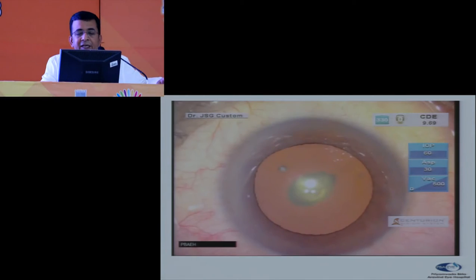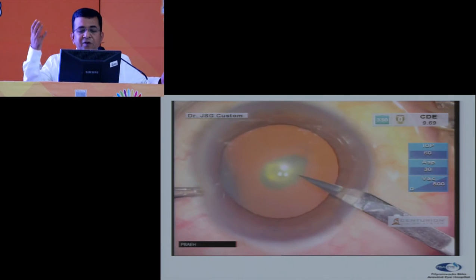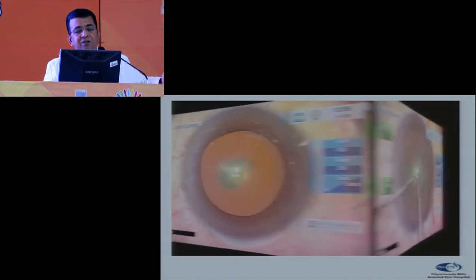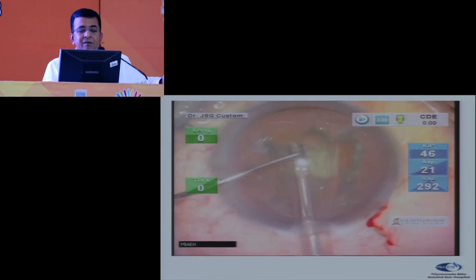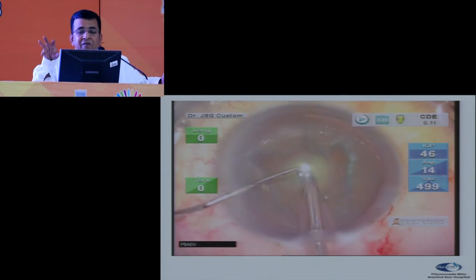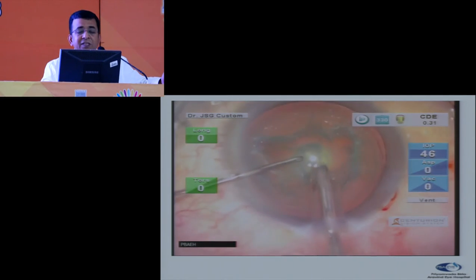So we will have our first case, which is a situation of posterior polar cataract. And just like anybody, my thought process is like when I see a banana skin, I know that I will slip again, I will have a fall. So when I have a PPC, I know I'm going to land up in trouble. I curse people, I get angry at the retina surgeons, why they're born. But if you see, we have reduced the IOP, we have reduced the aspiration flow rate, yet we are able to maintain a higher vacuum with a stable anterior chamber.